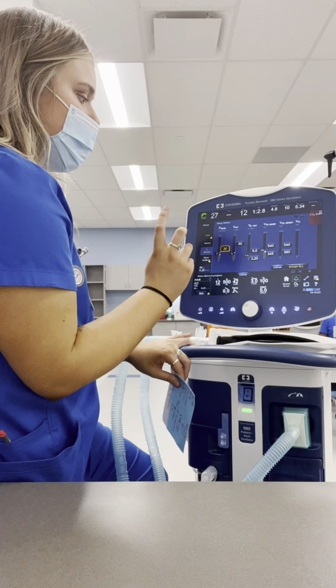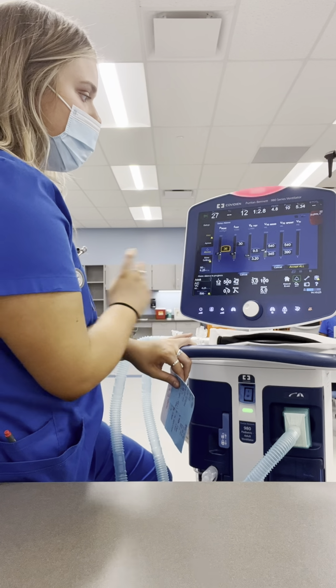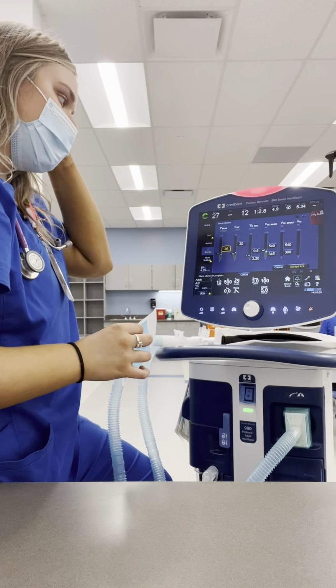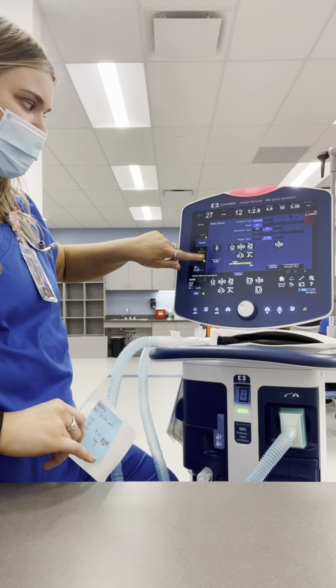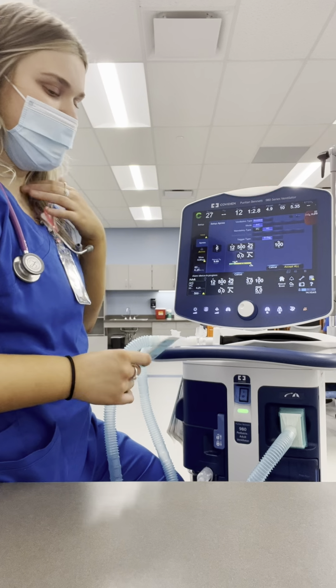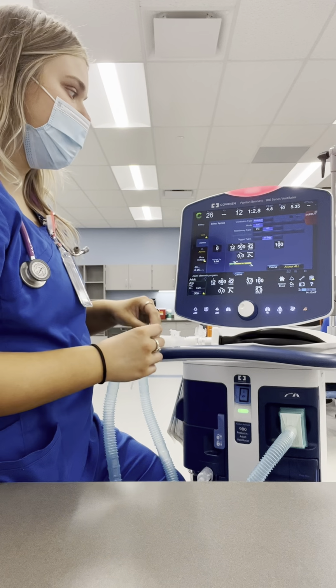And then for the tidal volume, he's currently getting 445 milliliters. So we put the high alarm at 540 and the low alarm at 345. And we're going to accept that. But first, we're going to put the apnea alarms. For the time on the apnea alarm, I put that as low as it'll go, which is 6 seconds, so that they miss a very minimal amount of breaths.